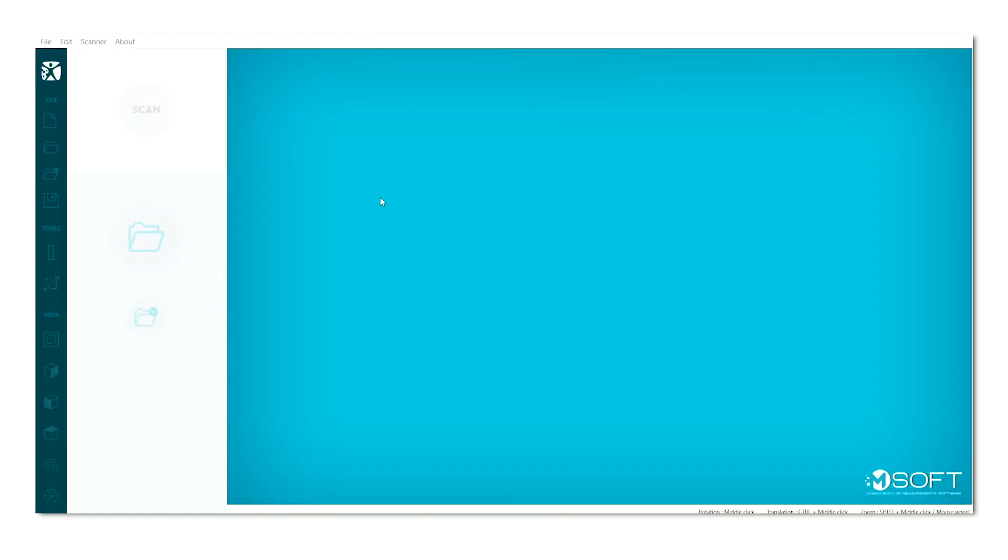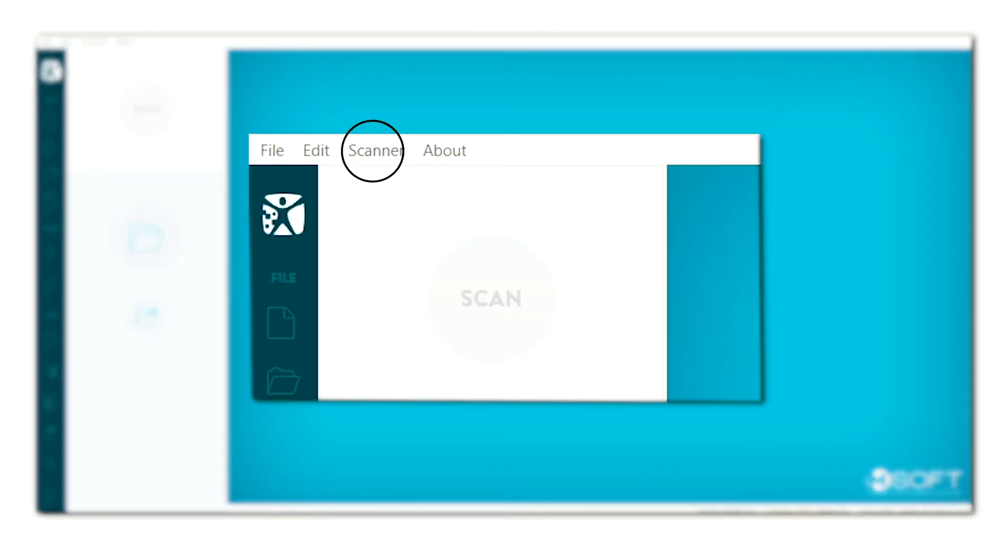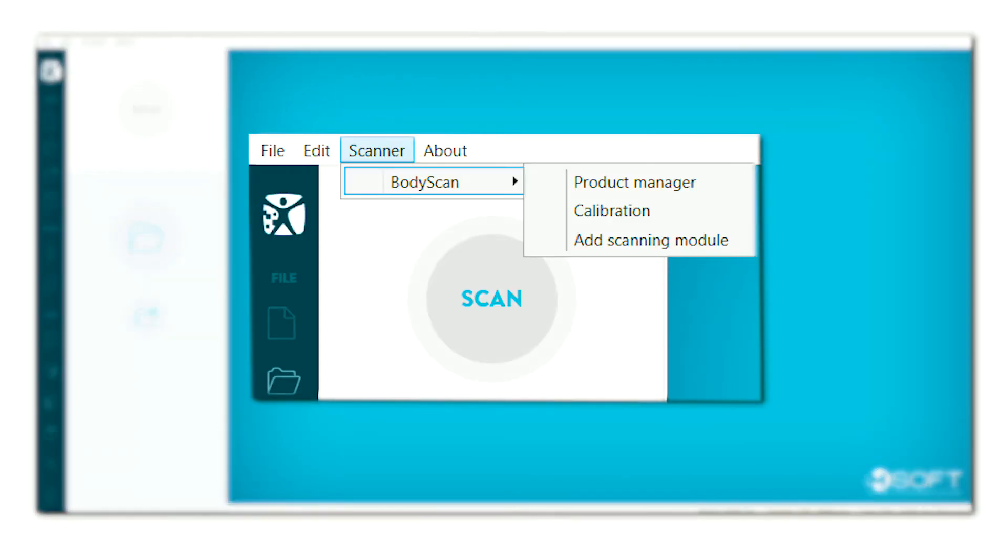In the MSoft menu bar, click on scanner, then on body scan, and finally on calibrate.